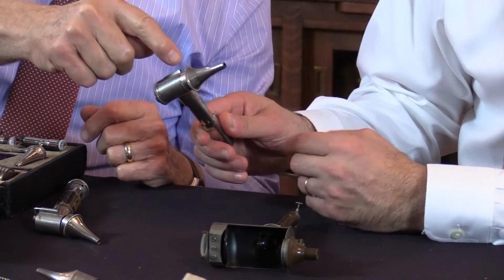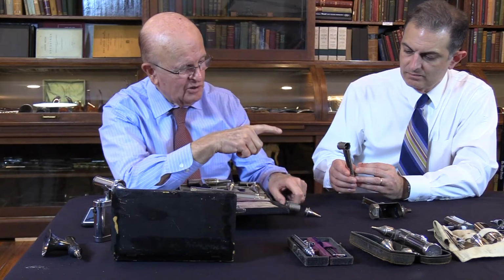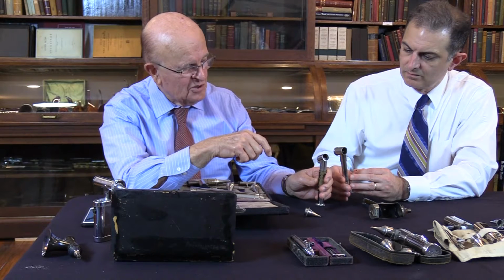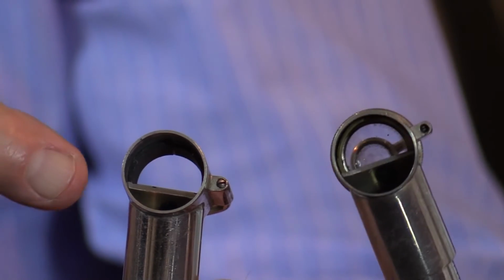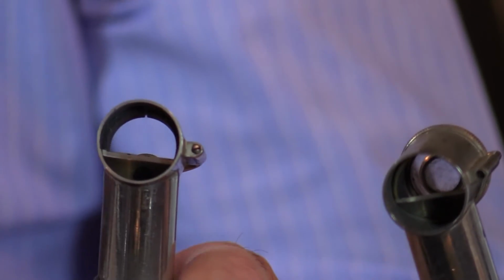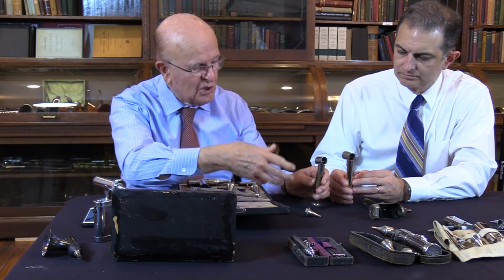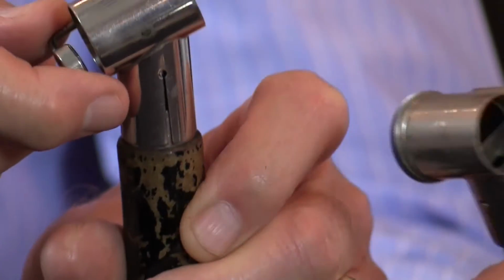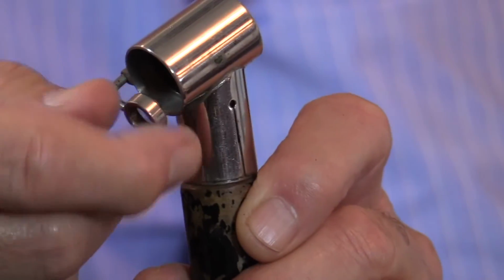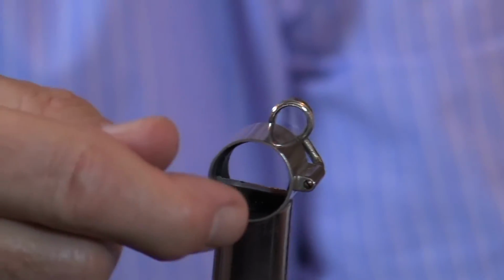I think it will show if we remove that. See the reflecting mirror here. While you are holding it, we can show this has a reflecting mirror, but it's half a mirror. So when you look through, you don't have to look through the hole in the center of the mirror. This is one more step in the development of the otoscope. You have a bigger space to look through. This is more of an operative otoscope because you have the magnifying lens here, but you can introduce instruments.